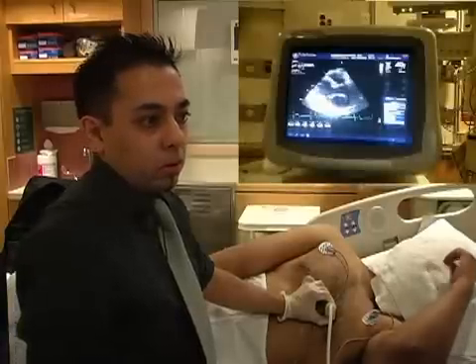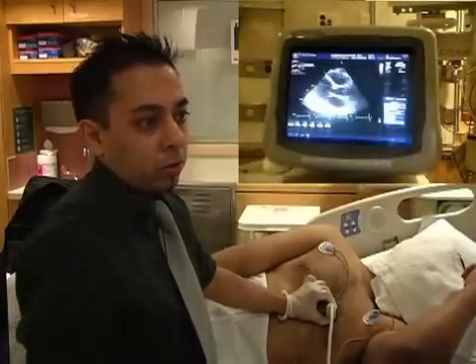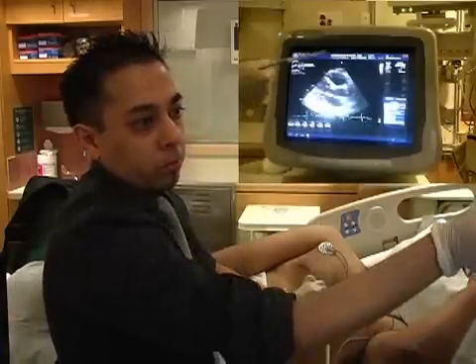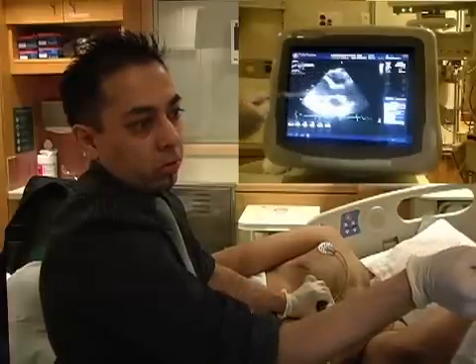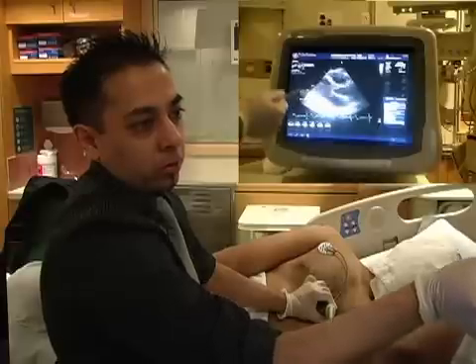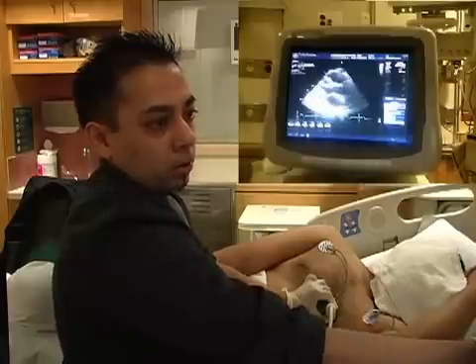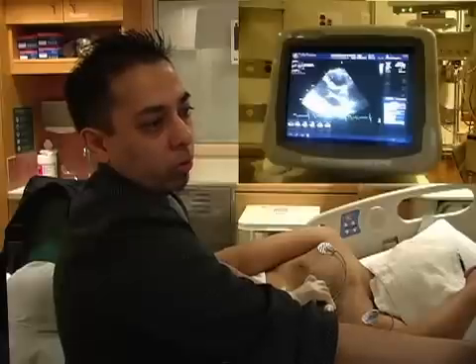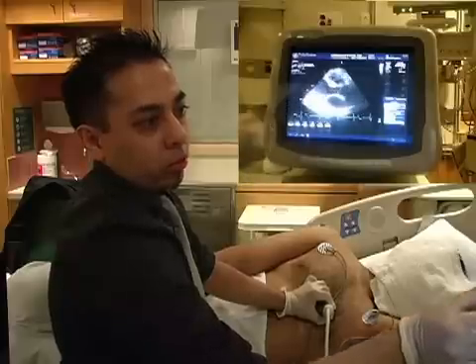This is the parasternal long axis view of the heart. In this view, you see several chambers. From top to bottom: the right ventricle, the left ventricle, the left atrium, the outflow tract where you see the aortic valve, and the mitral valve. The segments of the left ventricular wall visible in this view include the anterior septal wall and the posterior wall.